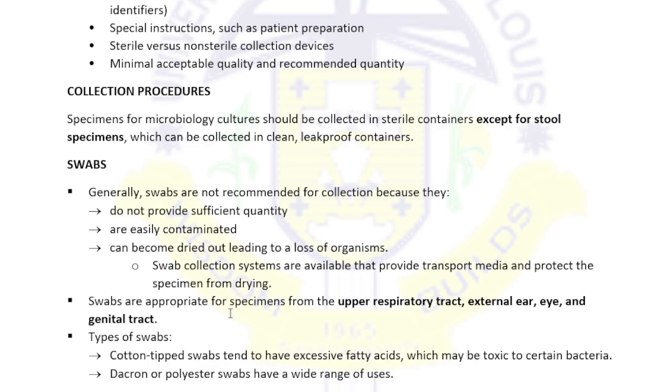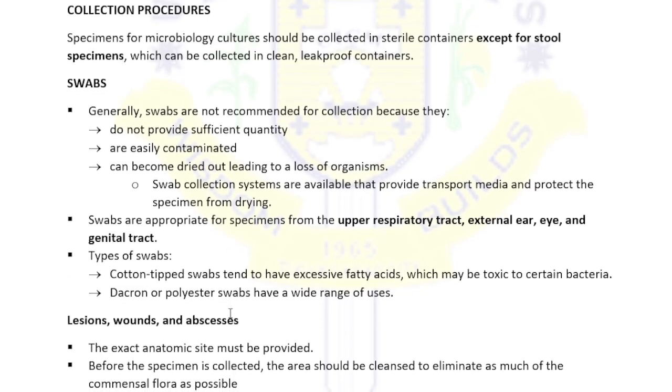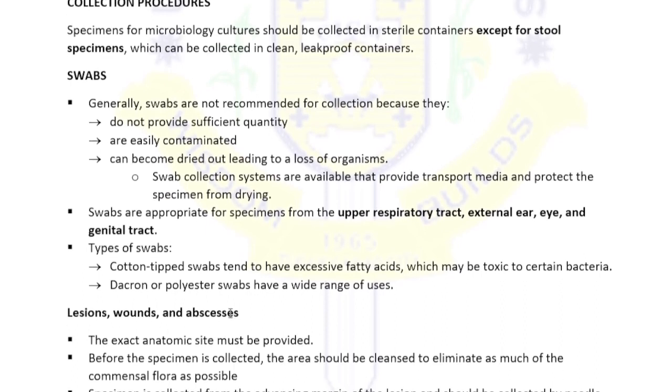So, we have here types ng swab: cotton tip swab, and then dacron or polyester swabs. However, in my experience, usually ang ginagamit lang namin is cotton tip swabs.